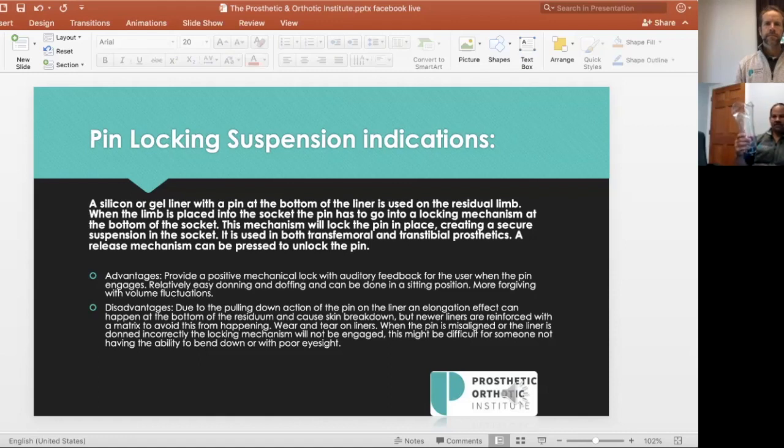They may say to me, I'm having a lot of pain on my patella, which is right up in the kneecap area. And it is important, especially as a new below knee amputee, that we address these areas. Patella, fib head, and distal end of the tibia on the anatomy. Those are areas that do not tolerate pressure at all. So those are areas that have to be dispersed, taking the pressure off of those bony prominences. We do that with your prosthetic socks by lifting the residual limb or creating a better environment for the residual limb to sit inside the socket.